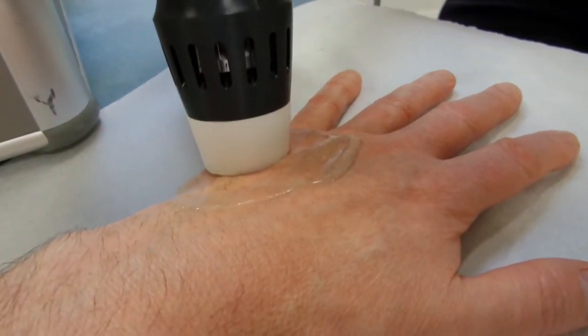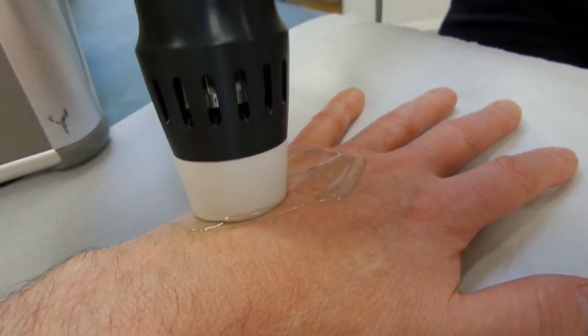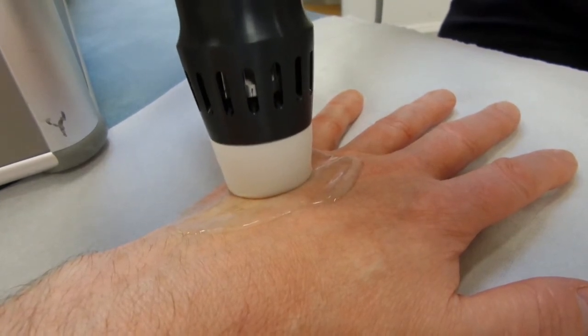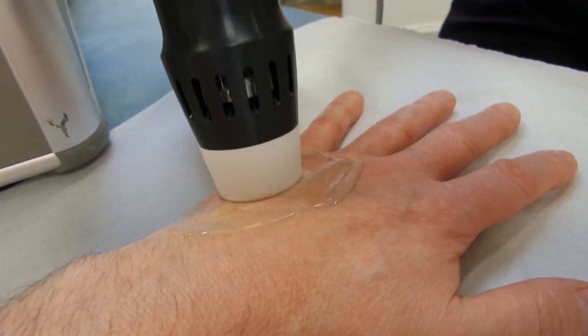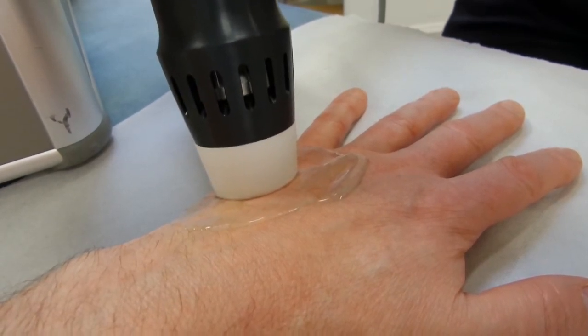Some people in the literature have actually done treatment as divided areas. We'll do two hundred shocks on each area and move around. Some people move the shockwave head in almost a massaging fashion and then just concentrate on the area as needed.